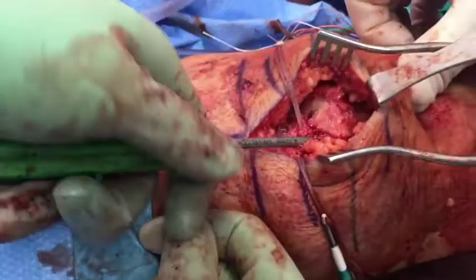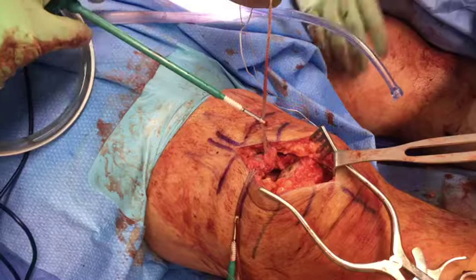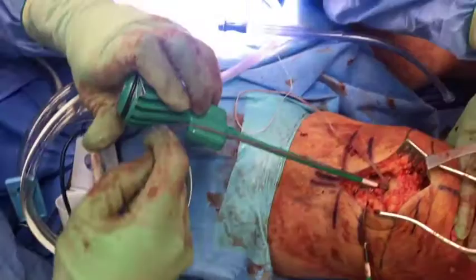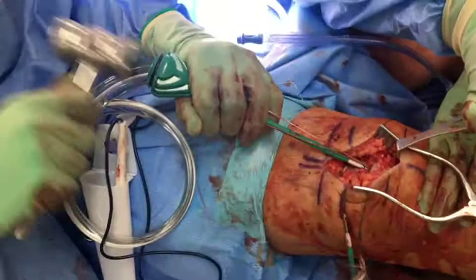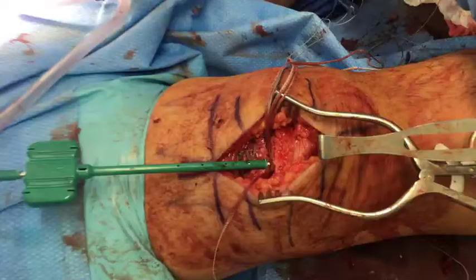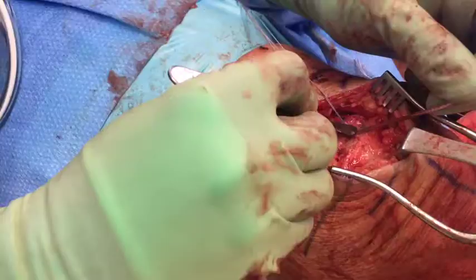Before inserting the anchors, the hole should be gently irrigated to remove any debris. The first anchor is then inserted into the hole, and despite drilling and tapping, this still usually requires a mallet given the bone density of the patella. It is critical to adequately tension the suture tapes to reduce the tendon to the bone. Once the anchor is fully inserted, the inserter is removed and this is repeated using the second anchor. The suture tapes are cut flush with the anchor and the core sutures within the anchor are left behind.